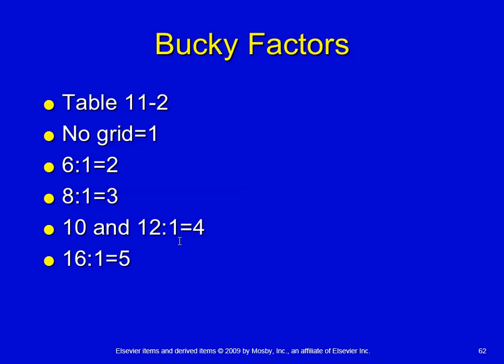Since the only thing that you're looking for is whether or not the NG tube came below the diaphragm, you can kind of get away without shooting the abdomen with a grid. So in a case like that, you would position high and you could shoot without a grid. Most of the time your techs are still going to shoot with a grid, but if you don't have one, it's really not worth going down to the department to locate a tape-on grid to go back up to the floor and take an X-ray on the patient.